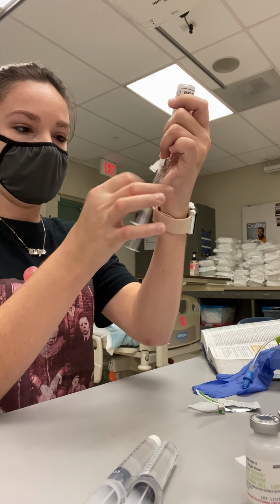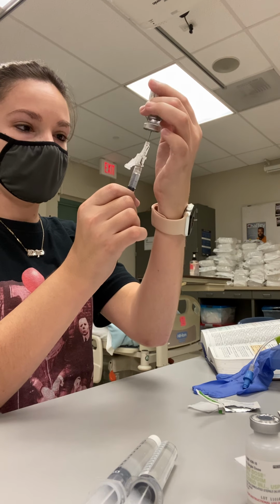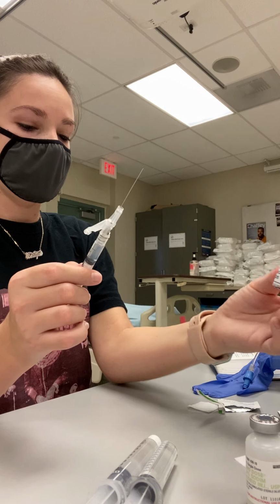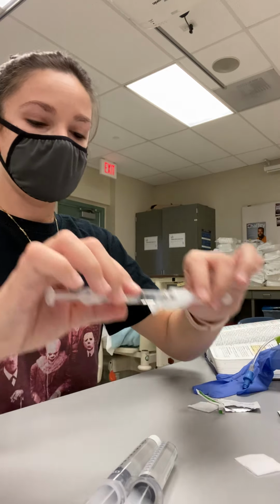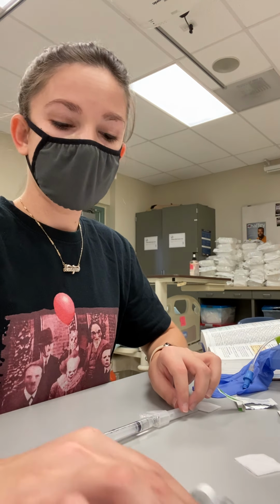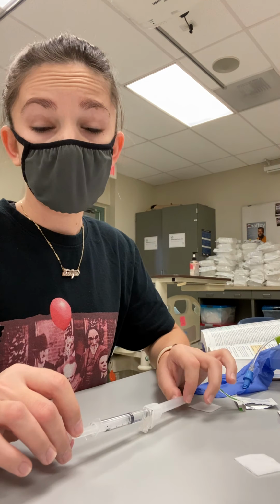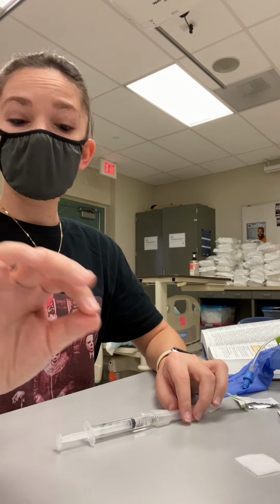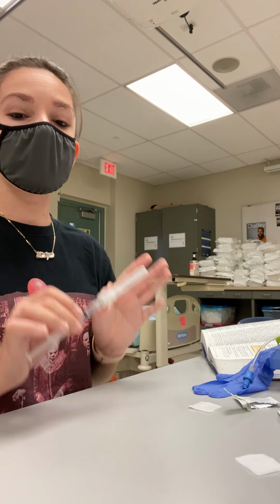Make sure there are no air bubbles. So you'll be checking that there are no air bubbles. And then you will recap one-handed. And then you will label your medication. So you will label 5 milligrams or 1 milliliter, and you'll put your initials. So you'll have a piece of tape and you'll write it down. And now you're ready for your second check.